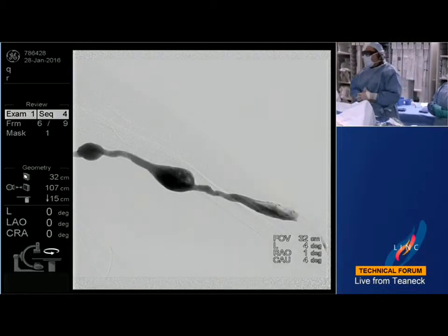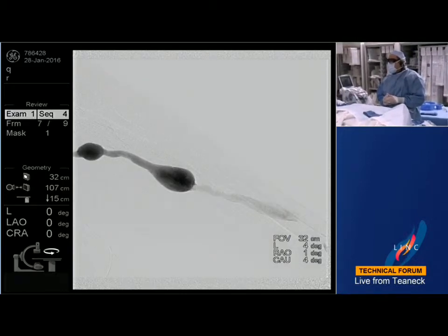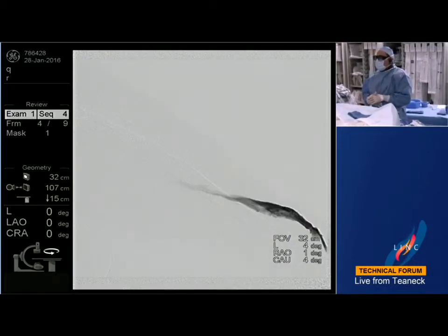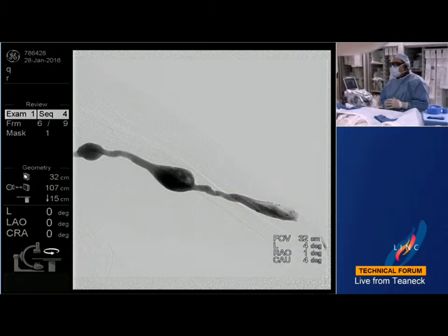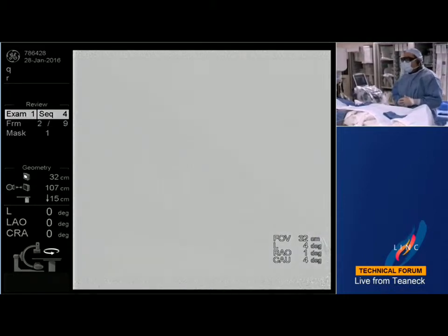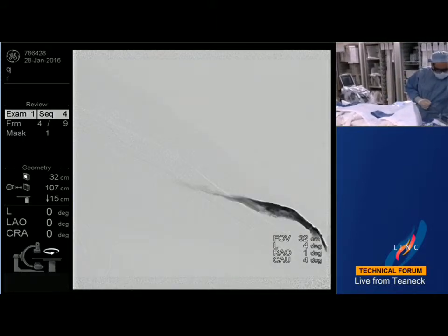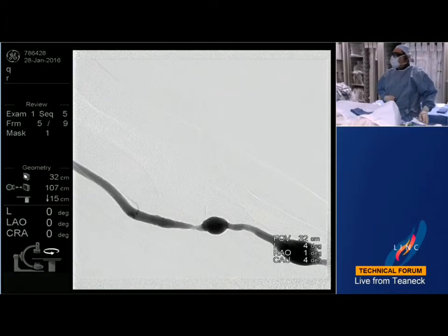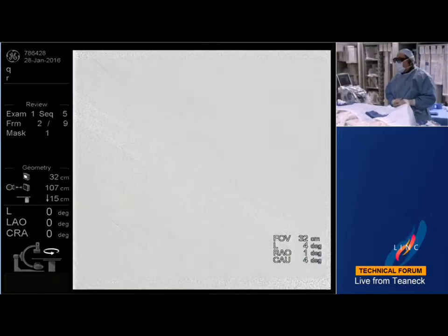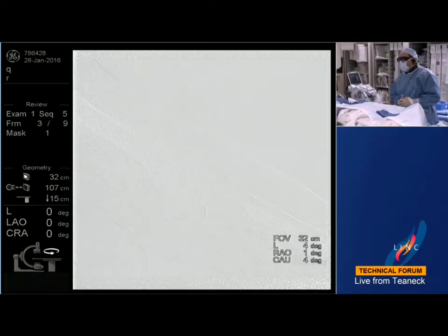Let's see if we can get the next one. We're going to have the first run right here, showing the multiple pseudoaneurysms with the area of relative stenosis as compared to the pseudoaneurysmal formation. And I always find that to be difficult. What do you guys utilize when you have a large area of pseudoaneurysm to decide whether the proximal or distal vein is more stenotic? So, thoughts from the panel? I think personally you can look at flow volumes and then just measure the absolute diameter. You really want to have at least a 6 millimeter channel to have a good conduit for a nurse to access.